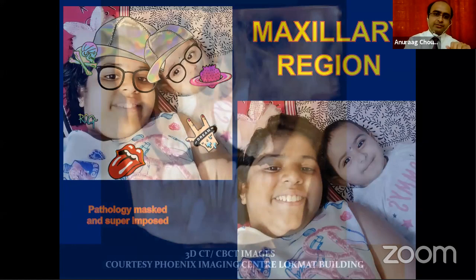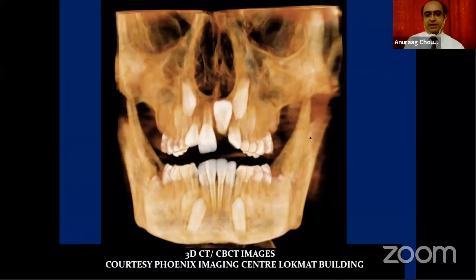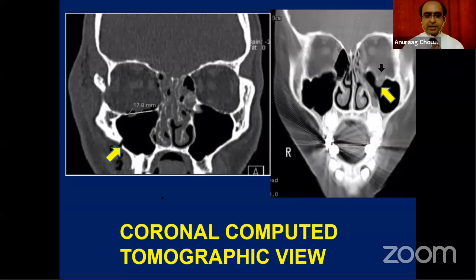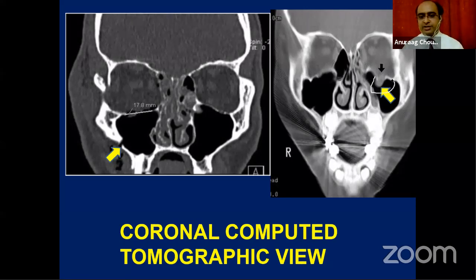I am grateful to my center for providing patient images without disclosing their identity. This computed tomographic coronal section shows the frontal profile. The Del Balso sign of symmetry demonstrates that symmetry is lost — there is a breach in continuity on the right side indicated by the arrow. In the next image, you can see fracture of the orbital floor and sinus roof, with orbital fat encroaching into the sinus — a soft tissue sign very nicely evaluated on CT.